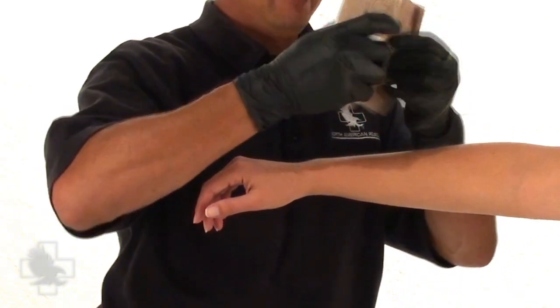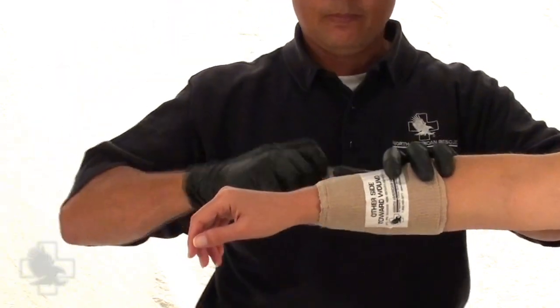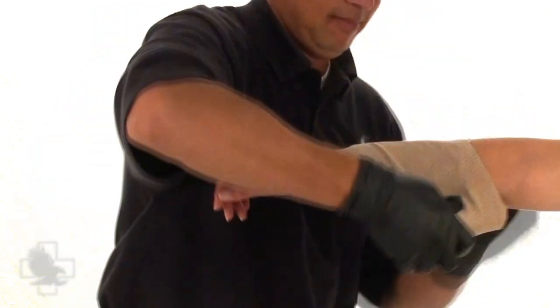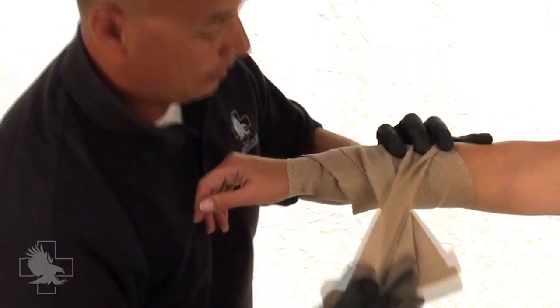Application is quick and simple. Once your package is open and the bandage has been removed, place the sterile, non-adherent pad over the wound and wrap the bandage around the limb. Pull it tight and wrap to cover the pad area, beginning on the edge farthest from the torso.